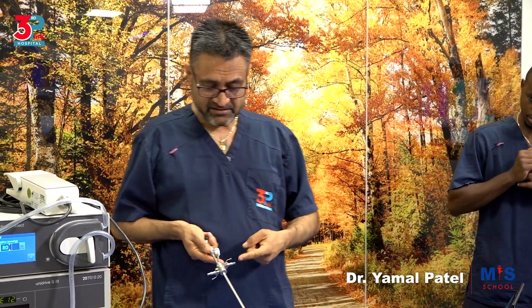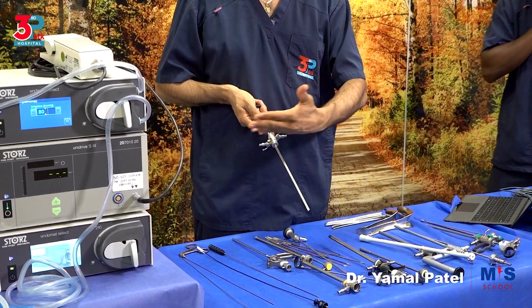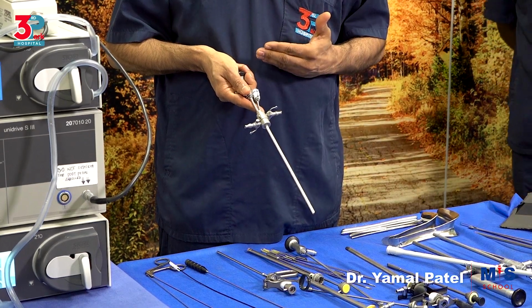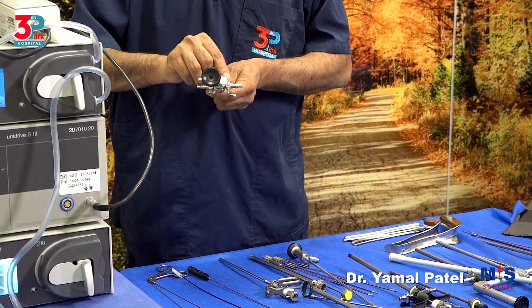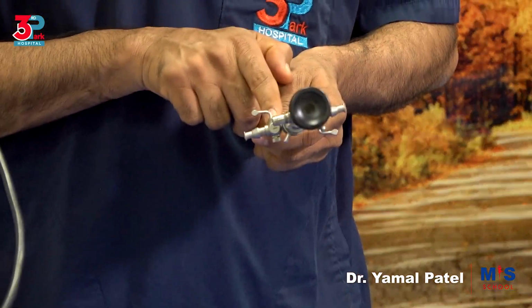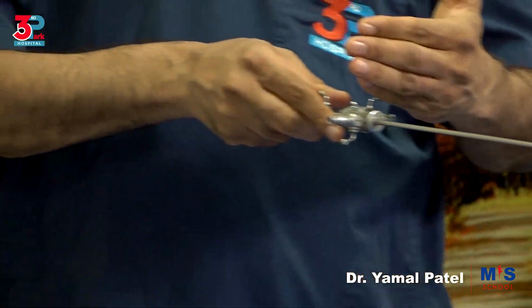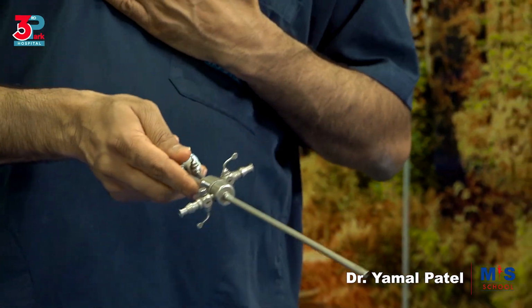How do you connect it? You connect it so that the in is usually closer to you, the out is away from you. The in is closer to you, and it has an arrow here that shows you an in. And this has an arrow here that shows you an out. So you follow the arrow, or you follow the basic idea that the in will always be closer to the operator.